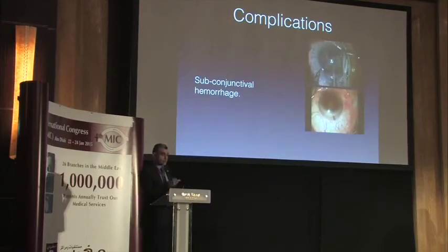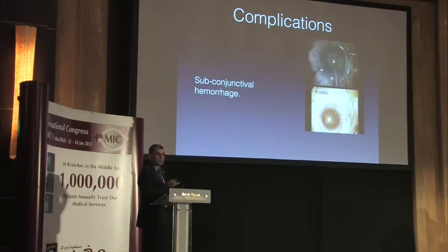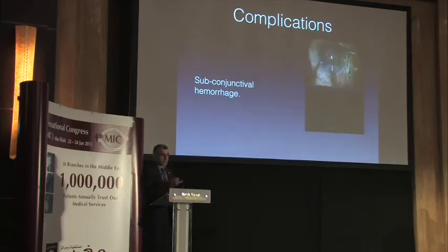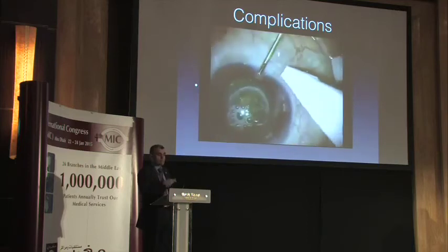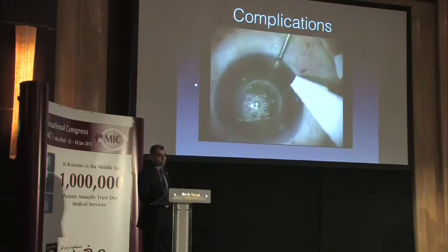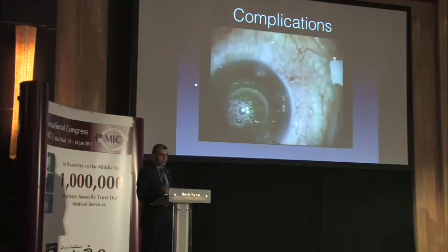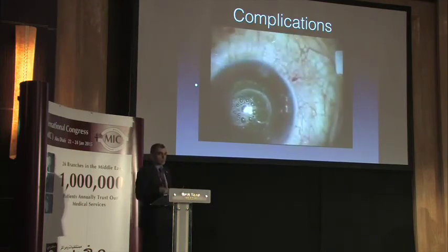This is a case showing the difference between regular cataract surgery and LenSx surgery. One thing that is so red in the LenSx is the conjunctival redness from suction — unlike regular cataract surgery where we have a white eye. This is just considered a drawback but usually resolves within one week. You may also have problems getting into the laser-made incisions — as in this patient, the primary incision was fine, but one sideport was very hard to open. Sometimes you have to be persistent. The trick to avoid this is to increase the superior and inferior laser limits to ensure full-thickness corneal cuts.